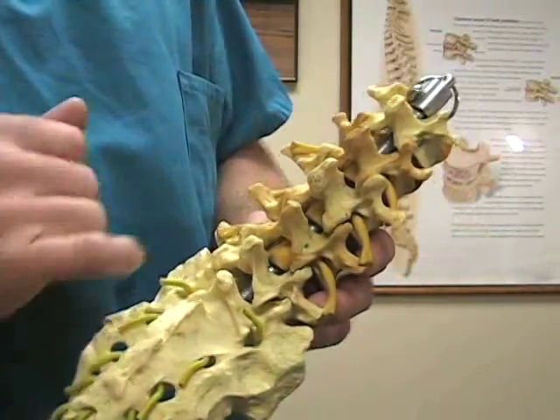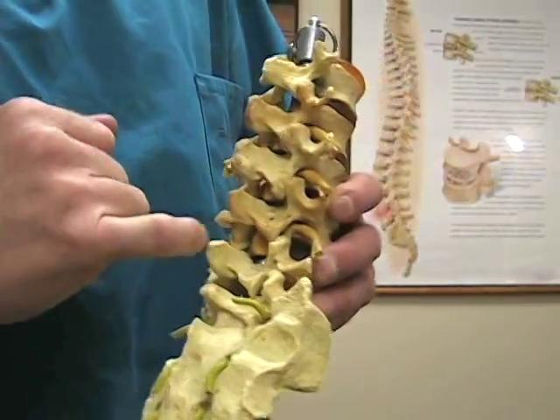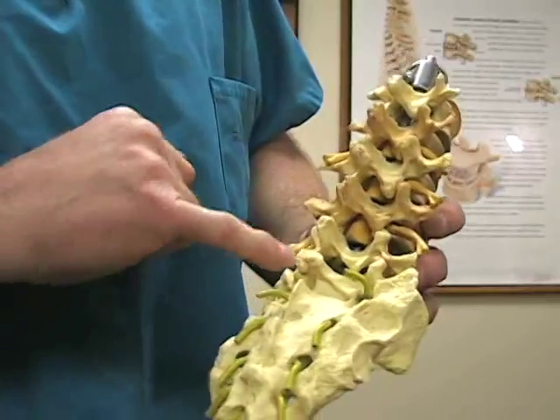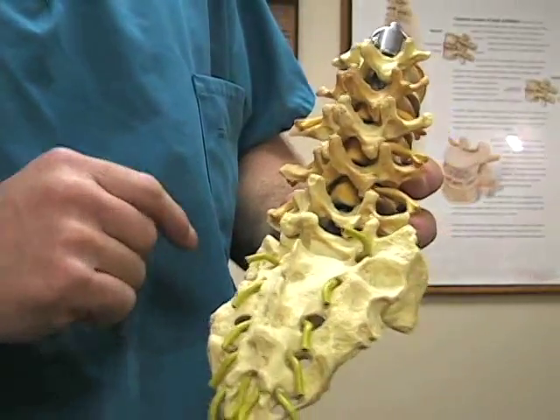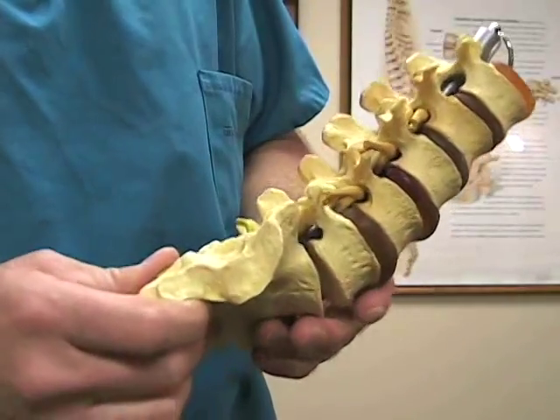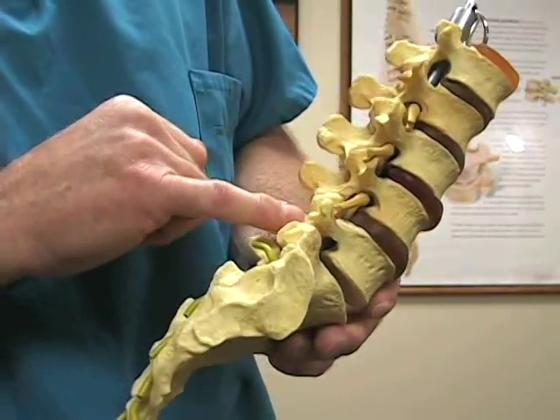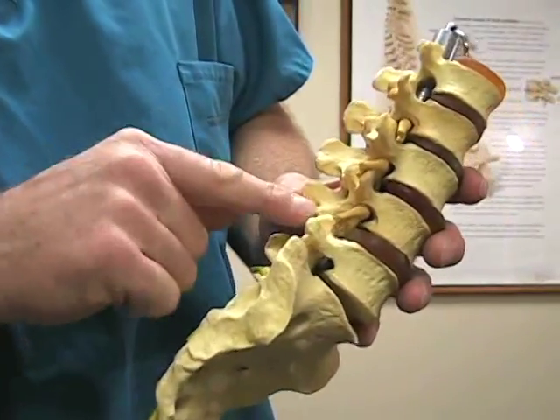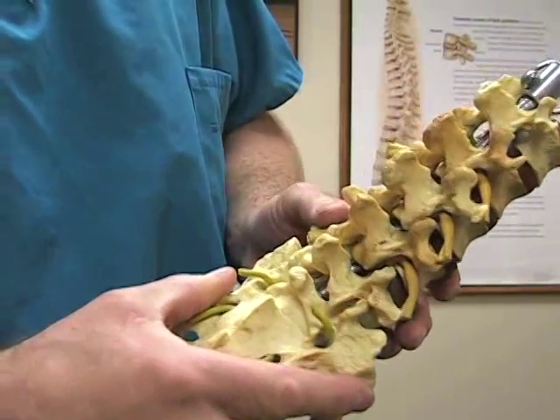As far as the general anatomy of the spine bone that we see here, these are the spinous processes. To the side of the spinous process on either side is what's called the lamina. And inside the lamina, where this metal rod goes down, is called the spinal canal. We see that on each side there's a hole where the nerve comes through, and that's called the foramen. The foramen is made partly by the bone above and below, by this structure here called the facet joint. So these are the joints in the spine.